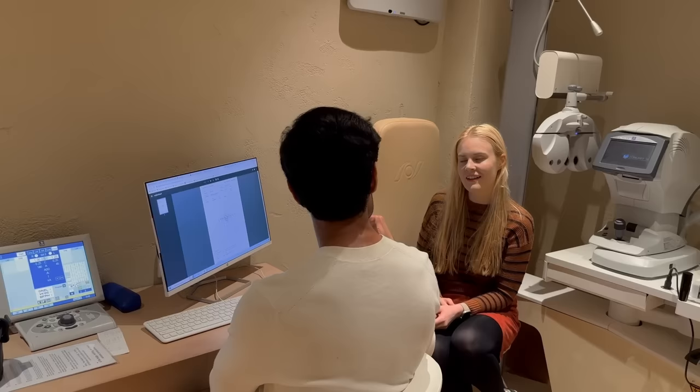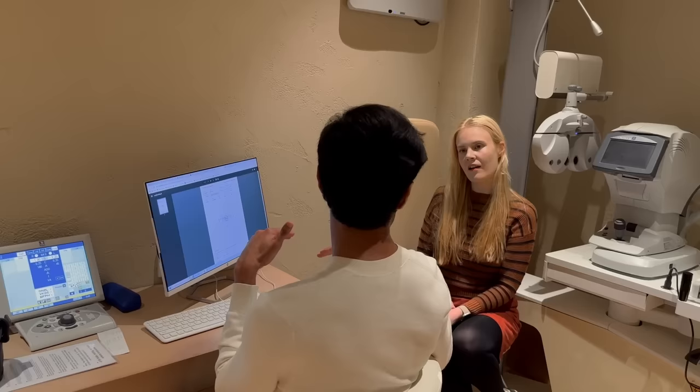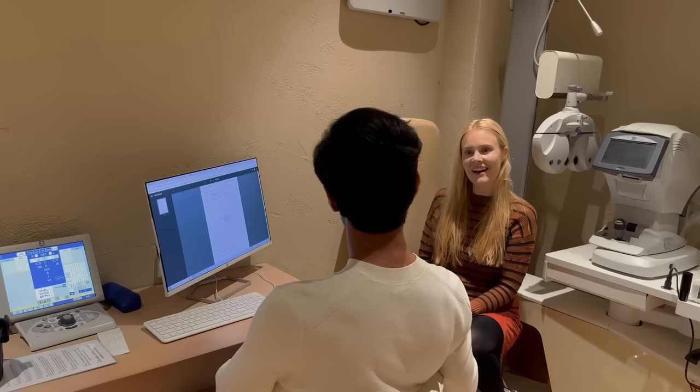Anything over 24, we might start to be concerned. It kind of changes throughout the day as well. So if you were to come in the morning, it can be higher than if you were to come later in the day. Today's a bit later, so I think it's good anyway. That's just something to keep an eye on.